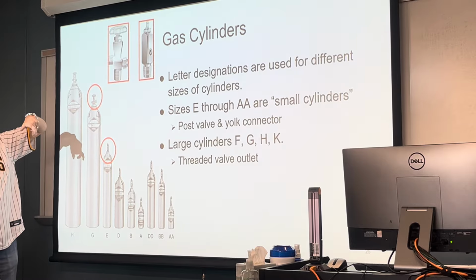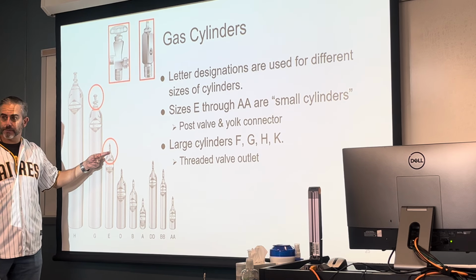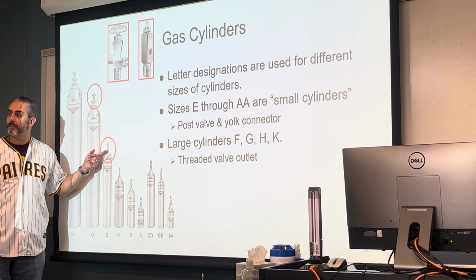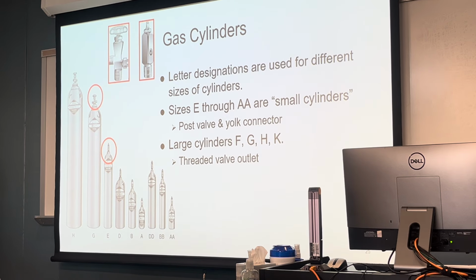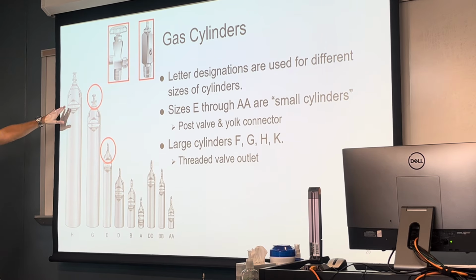You turn that a good quarter turn, and you will suddenly hear the gas come spilling out of there. It's going to make you jump. It's going to make people next to you jump, especially if they weren't expecting it. Because again, think about how much pressure is inside these tanks. That's why it makes such a loud, demonstrative noise as you turn it on. And same thing with these. You turn it on, it's going to come blasting out of there very, very fast.